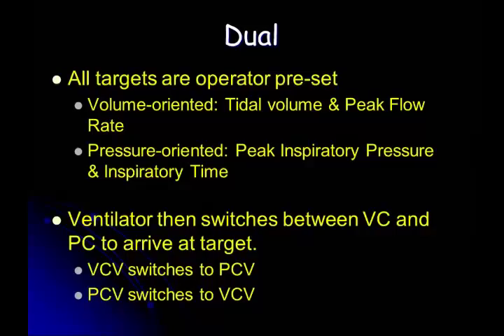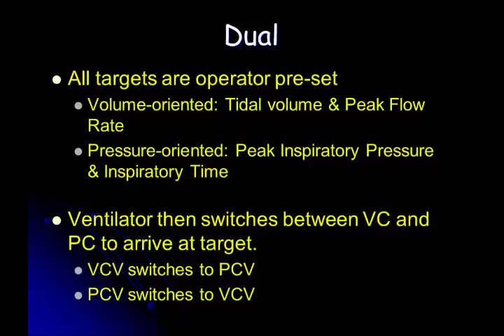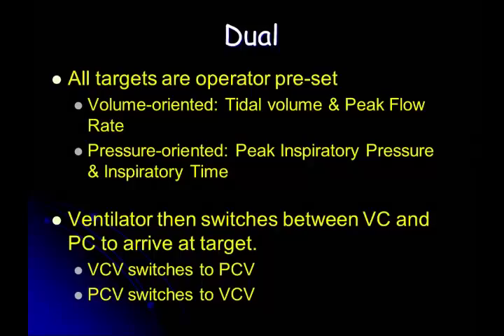Agreed? When I'm in pressure as a set point, I'm controlling the pressure. You really can only control one thing at a time. As much as we like to think that we can multitask, you really can't. At least the ventilator can't. It's pretty stupid.